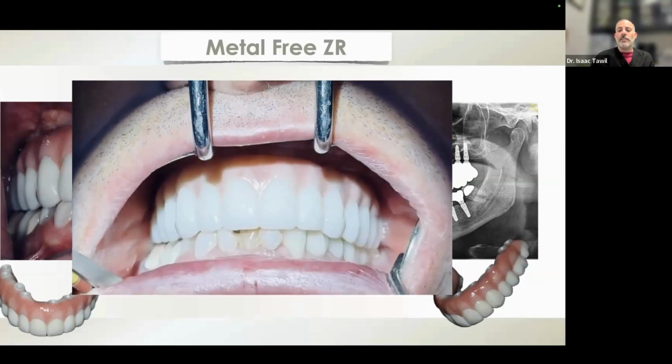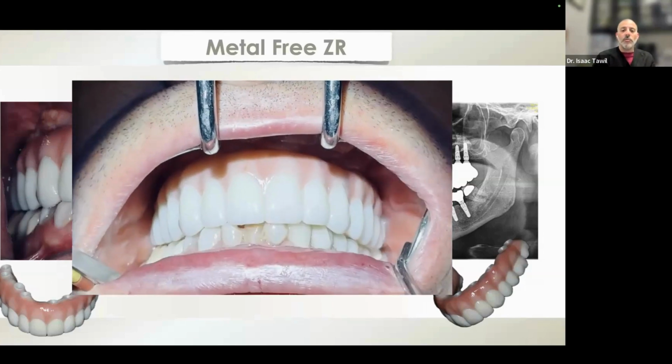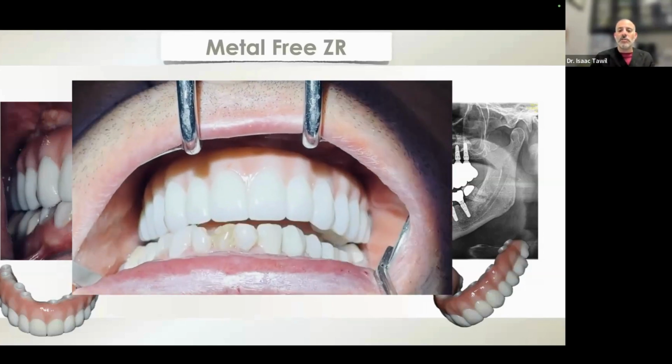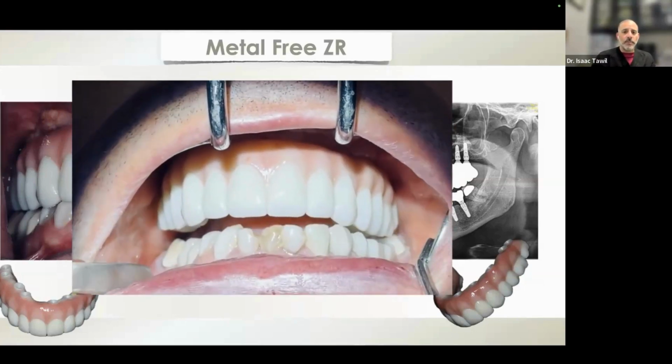And you can see the bite. This is the best part. The bite's always just like dead on. I never really have any issues. Obviously, he has some broken teeth on the bottom he has to take care of, but his excursive movements, everything is all captured nicely, and we're ready to roll for a healed ridge.